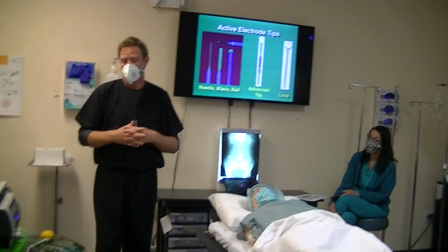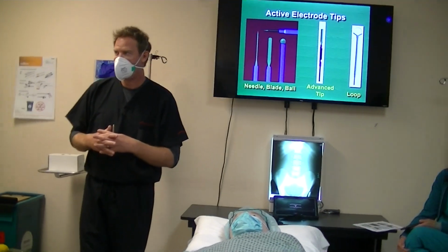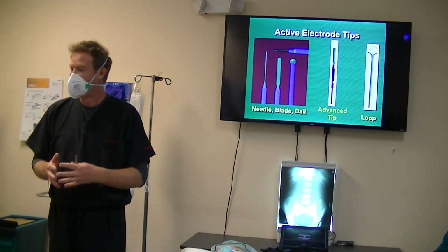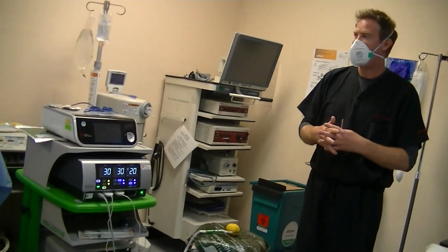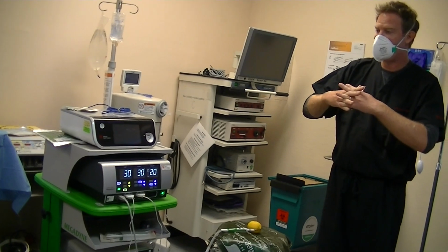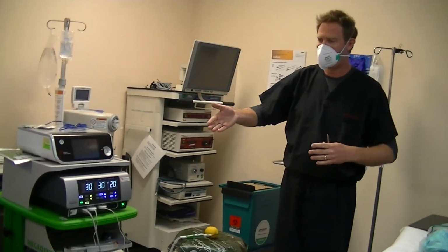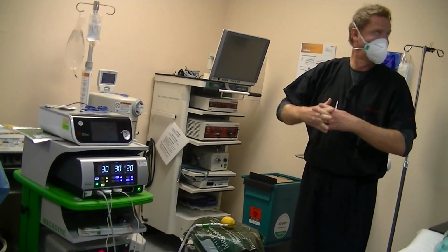Strength and actually the cosmetic result of that tissue. So there are modes of generators out there where you're going to get that same cosmetic effect, like if they're doing plastic surgery, and that wound strength, because both edges still have blood vessels rather than you just charring everything. So you're not going to get as big of a scar, but you also get more strength.